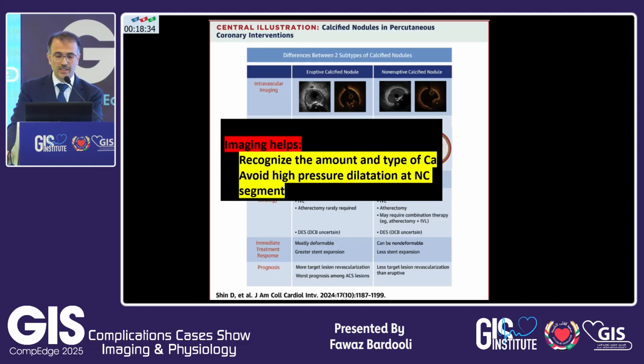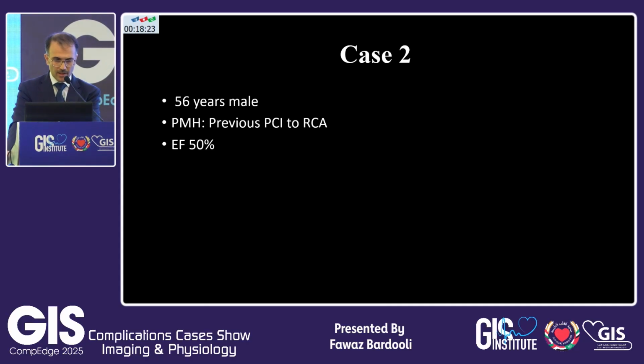So the imaging here helps me to recognize the amount of calcium, but not only the amount, the type, and avoid high pressure dilatation, which can cause a trauma and perforation. This is the second case.